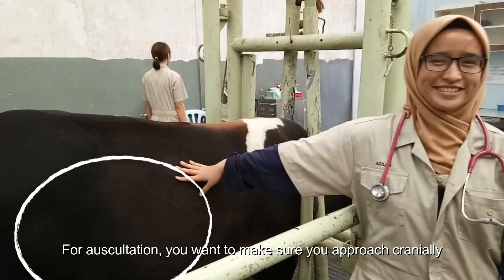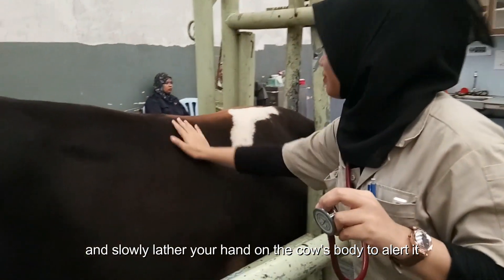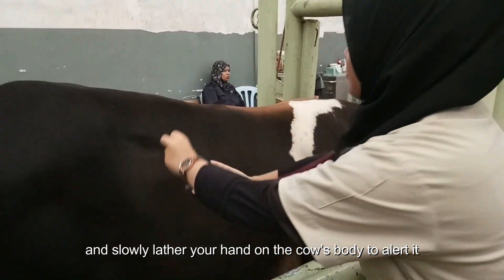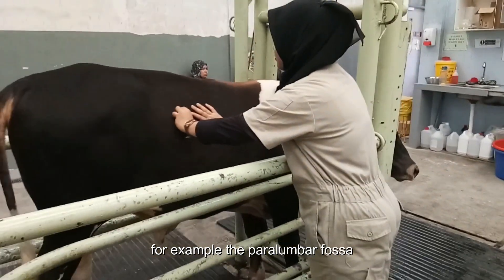For auscultation, you want to make sure you approach cranially and slowly lather your hand on the cow's body to alert it. Place your stethoscope at the region you want to auscultate, for example the paralumbar fossa.